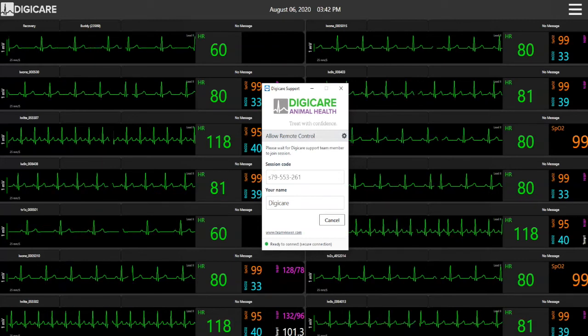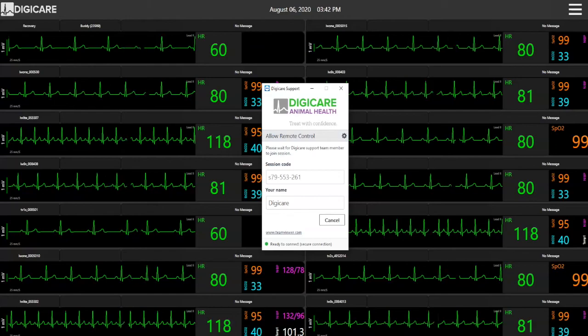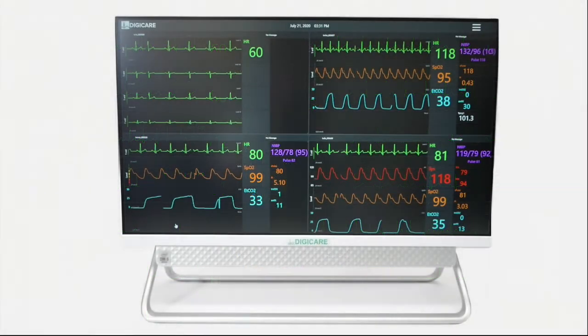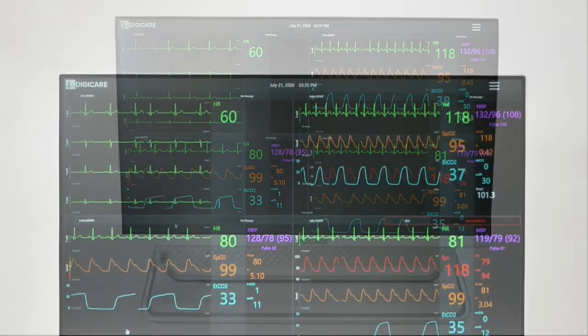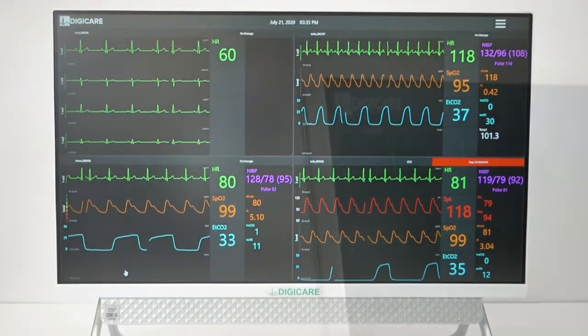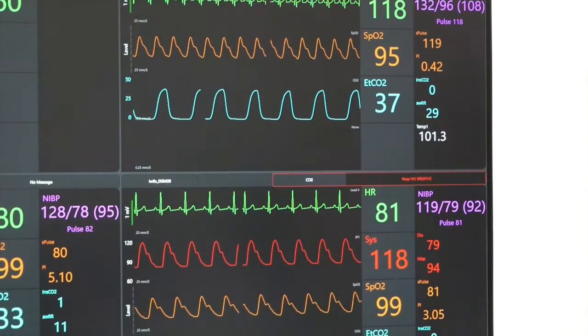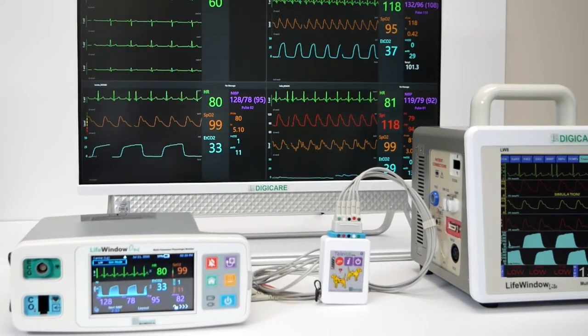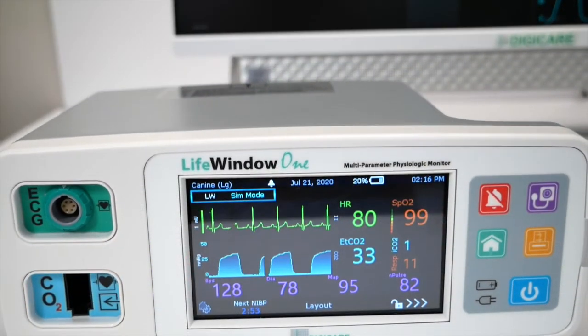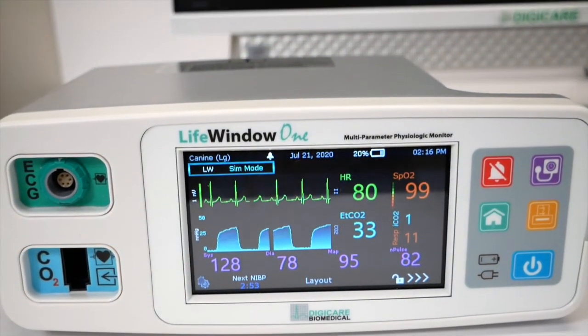The CentralView CV10X is the answer to your telemetry and central monitoring needs. This system is fully designed, manufactured, and supported in the USA. If you are interested in learning more about our CentralView CV10X, visit our website at www.digi-vet.com.